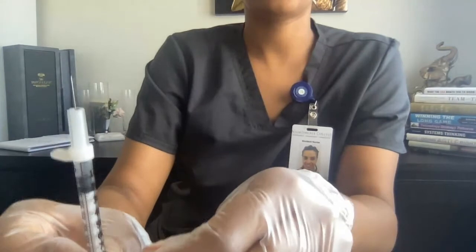Before I go ahead and administer this, I again make sure that I'm giving the right medication and the right dosage. That would be the last thing I check, because the order is 4 units of regular and 8 units of the NPH, a total of 12. So this is 12 units. I verify and combine the dosage against the MAR again. I can't be walking to the patient if I'm not prepping this at the bedside of the patient. I can't be walking to the room like this.